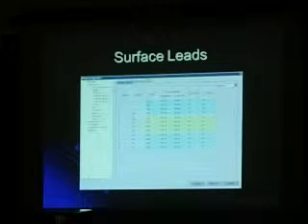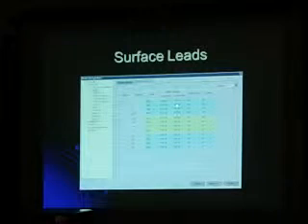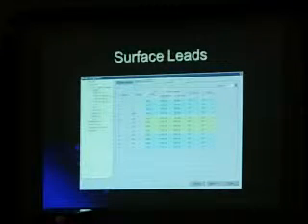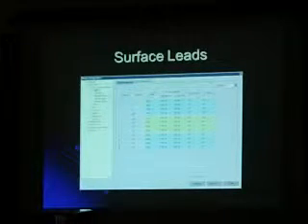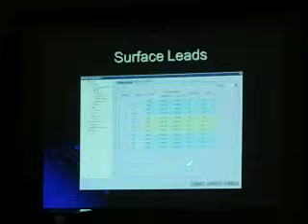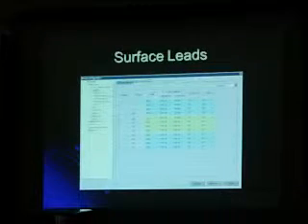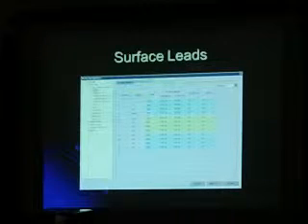But the other problem is our only setting under this is 40 hertz. And that will actually start flattening out our T waves. Not our T waves, but our QRSs. So we don't ever change our low pass on it. Now the notch filter we use because we're out on the body, we're in the air, we're getting all kinds of crud. So we use the notch filter as a default.